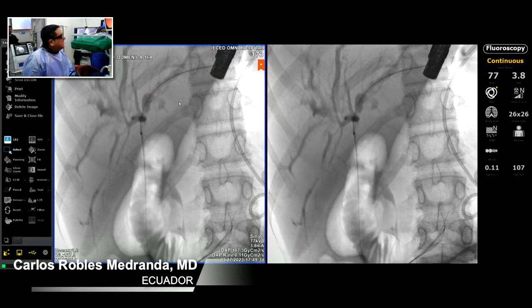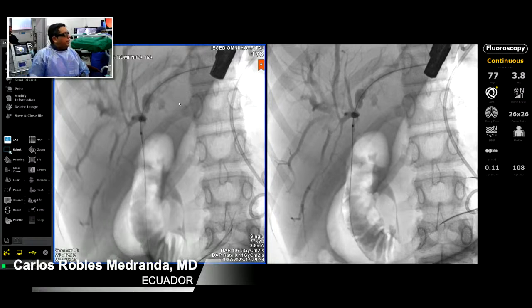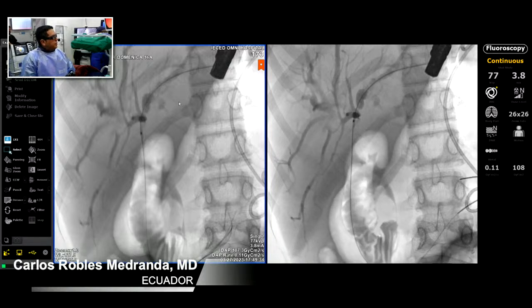Okay, so let's move. I need 10 millimeter. No, necesito un balón. Vamos a ir a la. Sí, no, necesito un balón para inyectar. Ya, ya está. Quiero inyectar desde arriba. Tengo un balón extractor. So we have the chance, huh?